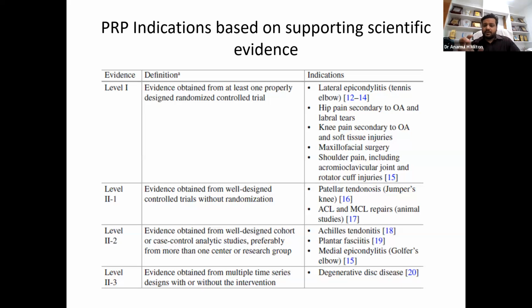Achilles is a very tough tissue and a very important tendon. Here tenotomy is very good for the tendon, but here we do very minimal tenotomy.